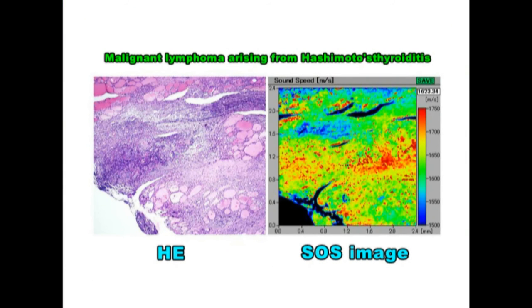This is malignant lymphoma arising from Hashimoto's thyroiditis. The lymphoma cells penetrate through thyroid follicles and destroy them. Several tiny dots corresponded to the fragmented red colored colloids. Most lymphoma portions have a fibrous background because of Hashimoto's thyroiditis, and are yellow-green in color.